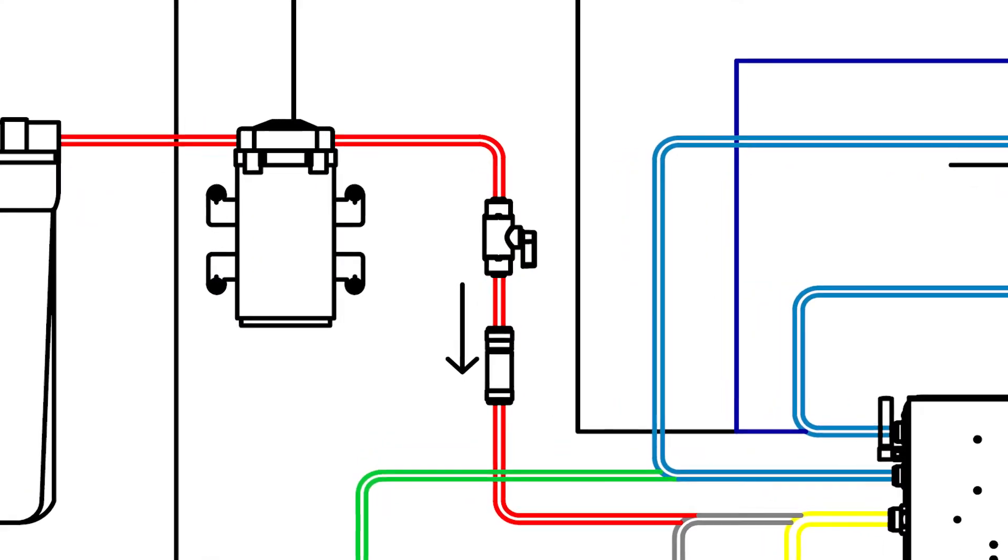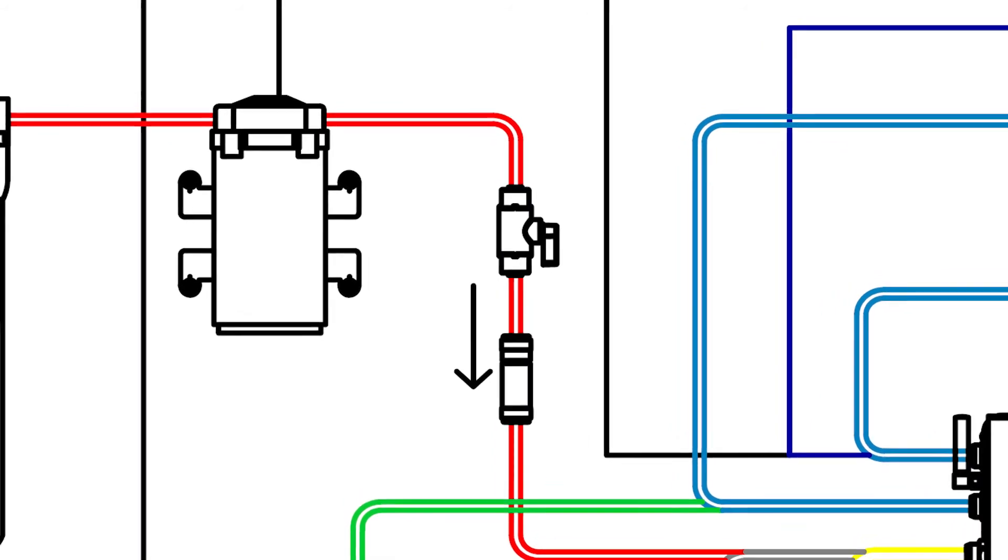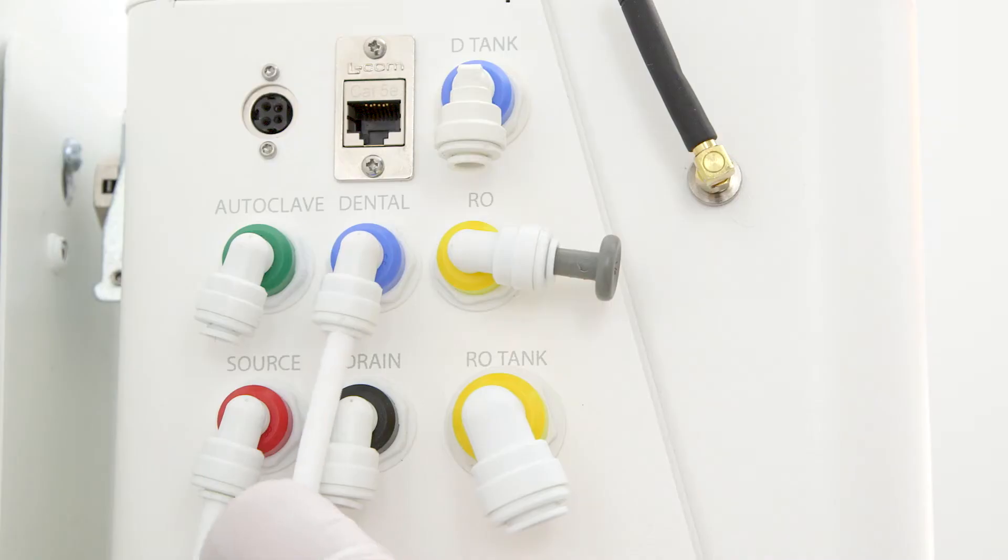Then run tubing from the out port on the booster pump to the source in port on the system. Once this connection is in place, make a cut and install an inline ball valve after the booster pump.